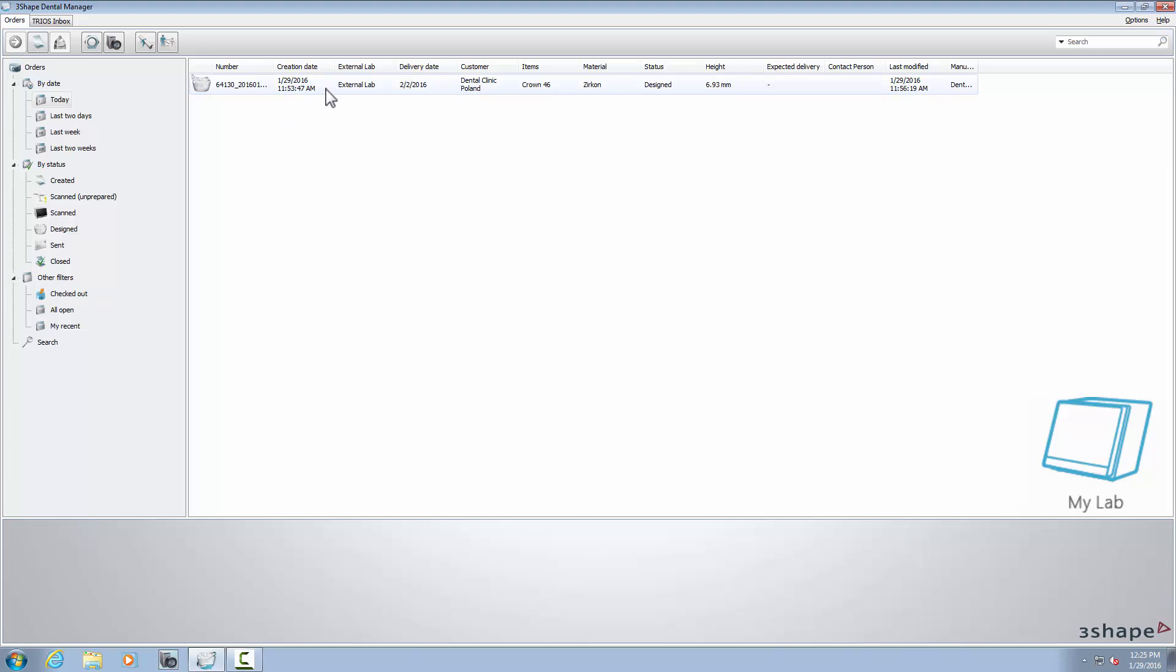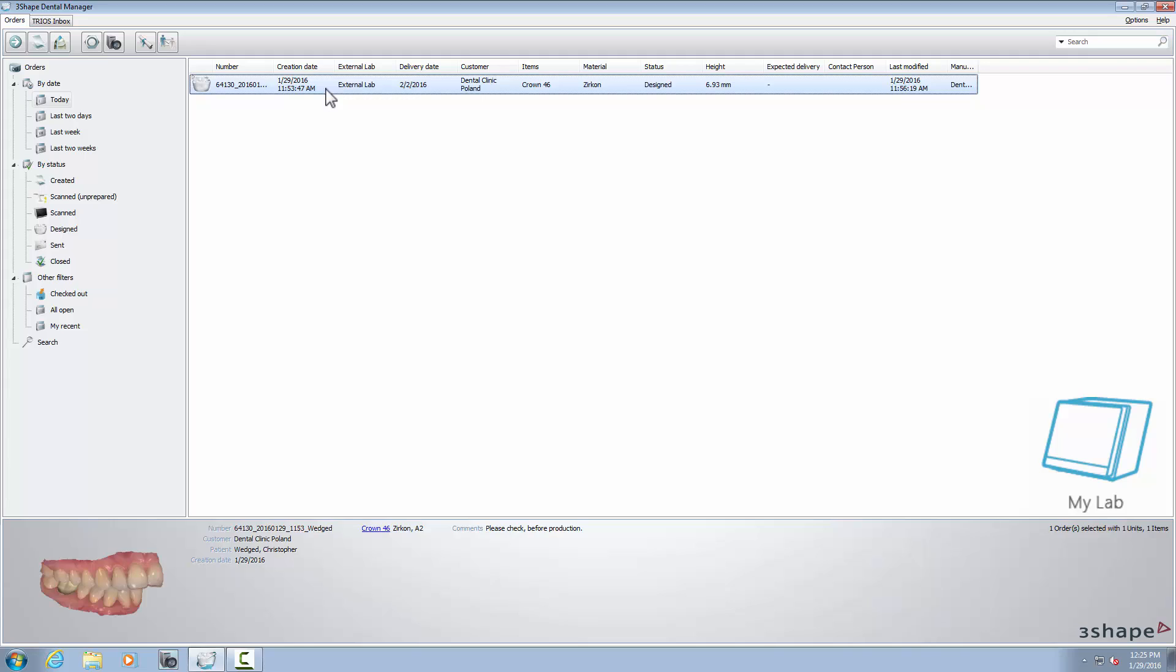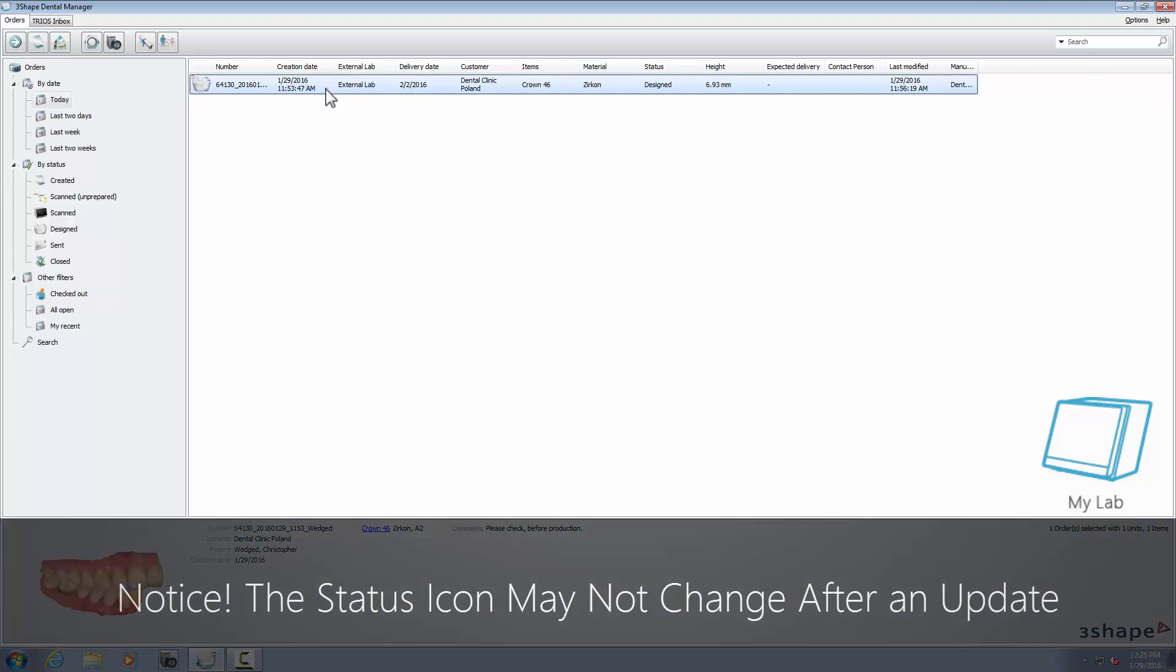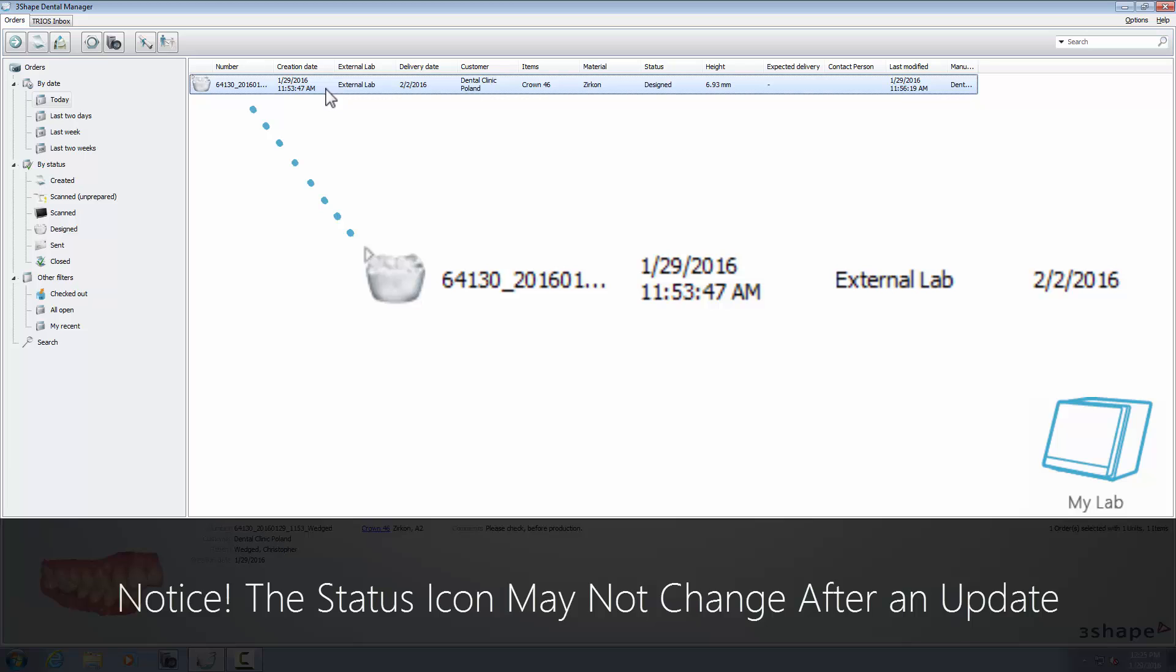Each time the external lab sends you an update, you will get a new order status for that case, straight after refreshing the list. In our example, the order status has changed from Scanned to Designed.